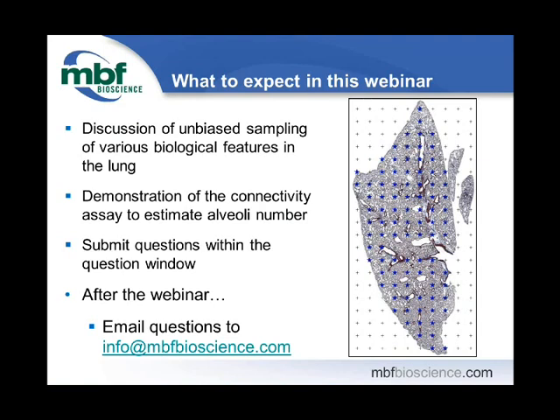When I'm done with that, my colleague Masha is going to take a more specific approach with one of these probes. Specifically, it's the physical fractionator modified to be used to count alveoli. If you want to come up with the number of air sacs in the lung, you can use this probe, and we are going to demonstrate how to do that in our software when I'm done giving a broad overview of all the probes that you can use.